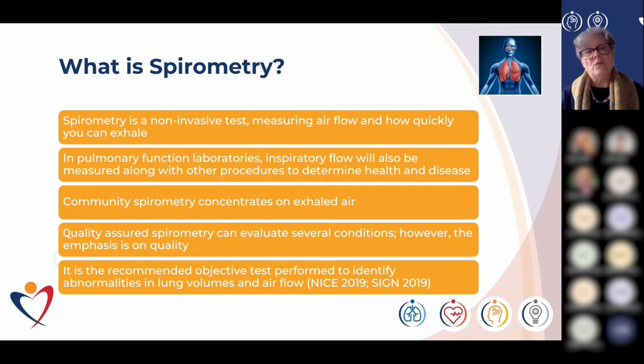So let's start then with what is spirometry. It's a non-invasive test measuring airflow and how quickly you can exhale. And we know that in pulmonary function laboratories, the inspiratory flow will also be measured along with other procedures to determine health and of course disease. Community spirometry concentrates on exhaled air, and that's what we'll be looking at today.